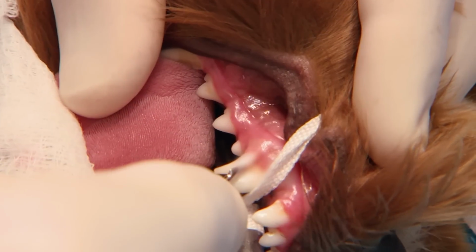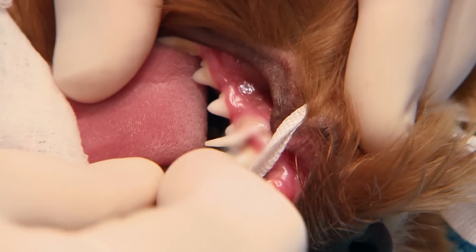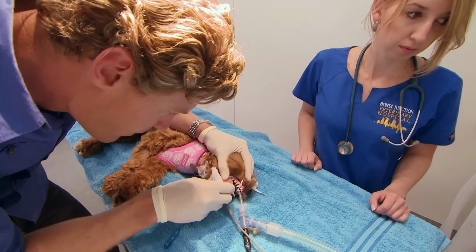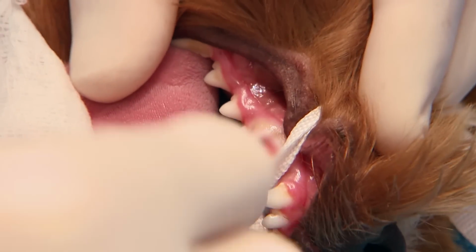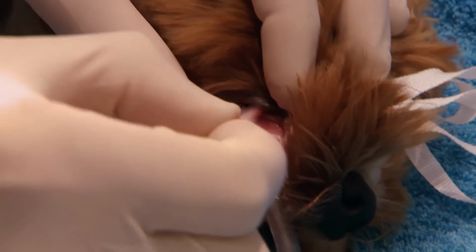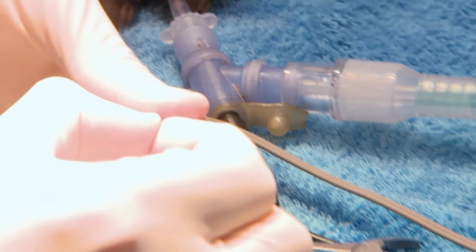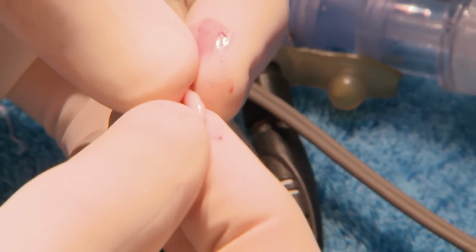The first thing I notice when I start working on the tooth is just how firmly attached it is. Normally these things, you can almost flick them out, but not this one. See, we're starting to get a bit of a wiggle there. If we can try to get around the base of it, you kind of just start to weaken its attachments. And then you find you have a tooth. That little guy was causing all the problems. You can see the body's trying to dissolve this root here, but hasn't really done much of a job there. That's been the reason it's been hanging on.